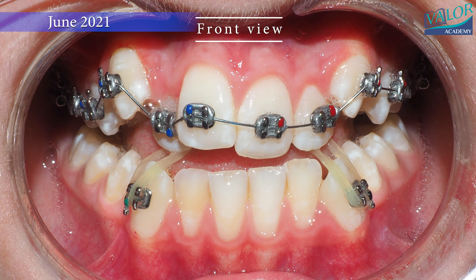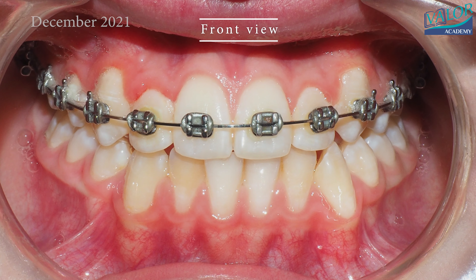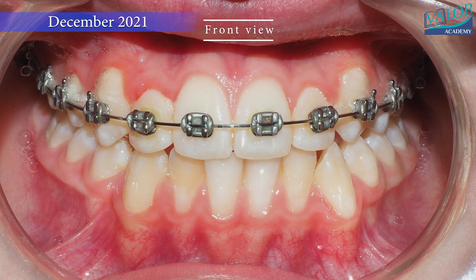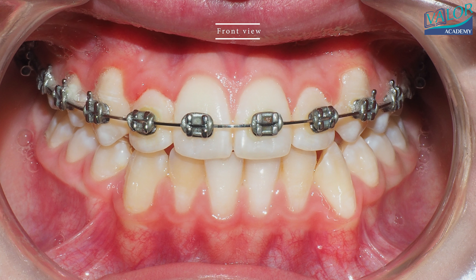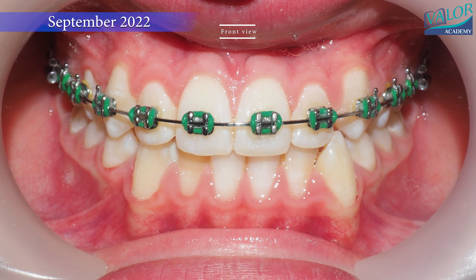Using criss-cross elastics can aid in correcting the crossbite. Sometimes a face mask and chin cup can be used to restrain the mandible and develop the maxilla.